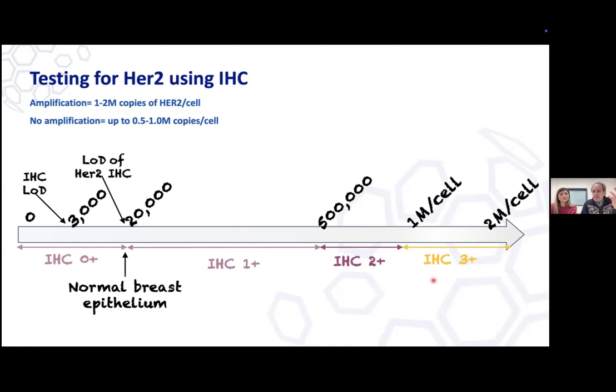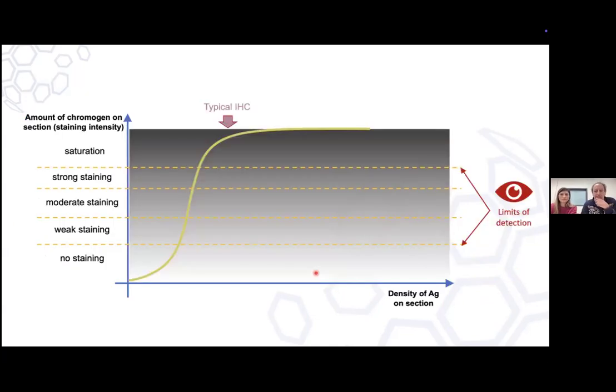In this scenario, the target of our attention is to identify this population of patients. And this one was a fail-safe. Is staining maybe not enough? Let's do a second test. And the second test was the in situ hybridization.